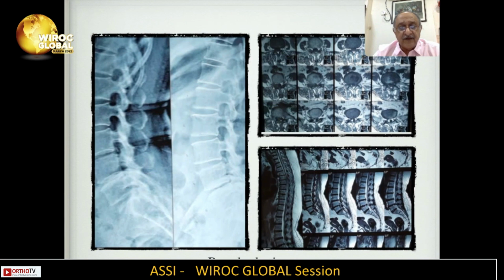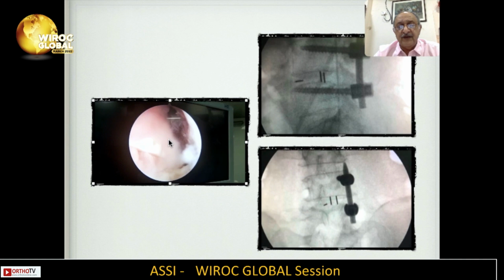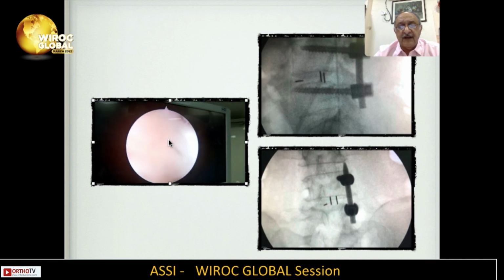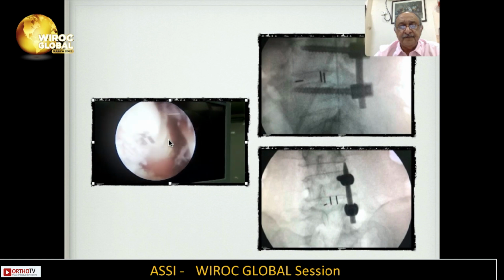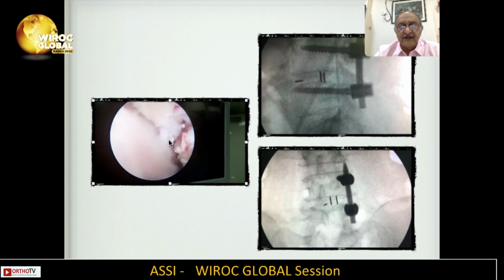This is a patient with retrolisthesis, collapsed disc, and you can see how beautifully we have fixed him. You can see the cage nicely put in, fixation done, and here you can see a video of how I put the cage in. The cage is going in under direct visual observation. It's taking its place in the canal. And now once that it is fixed into the disc, I'm banging it in. And you can see the cage. It's going in nice and tight.